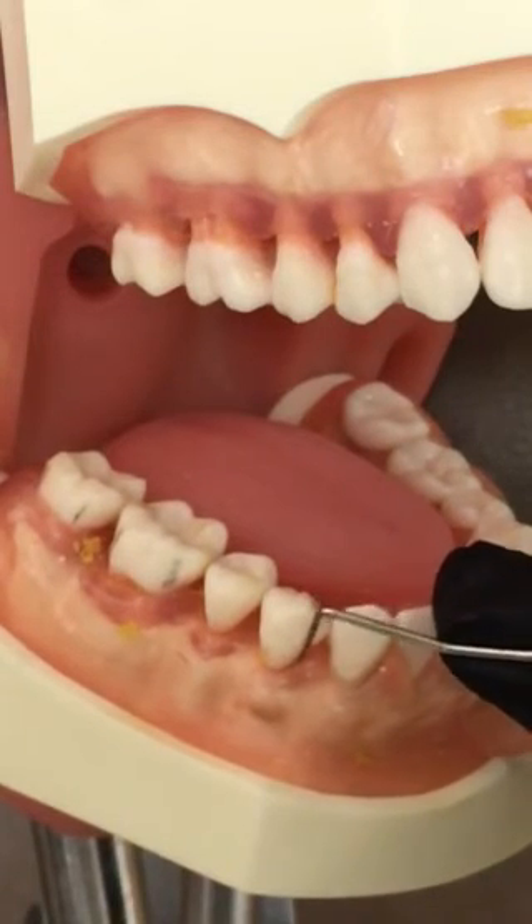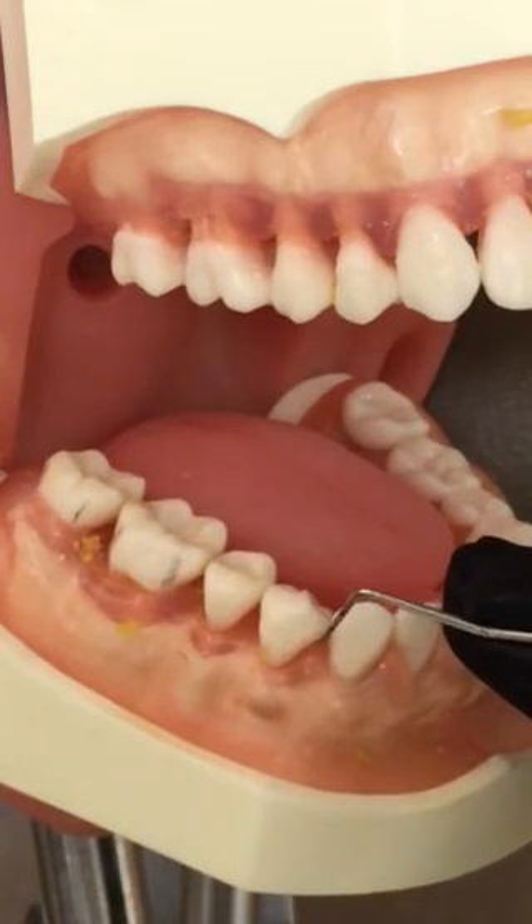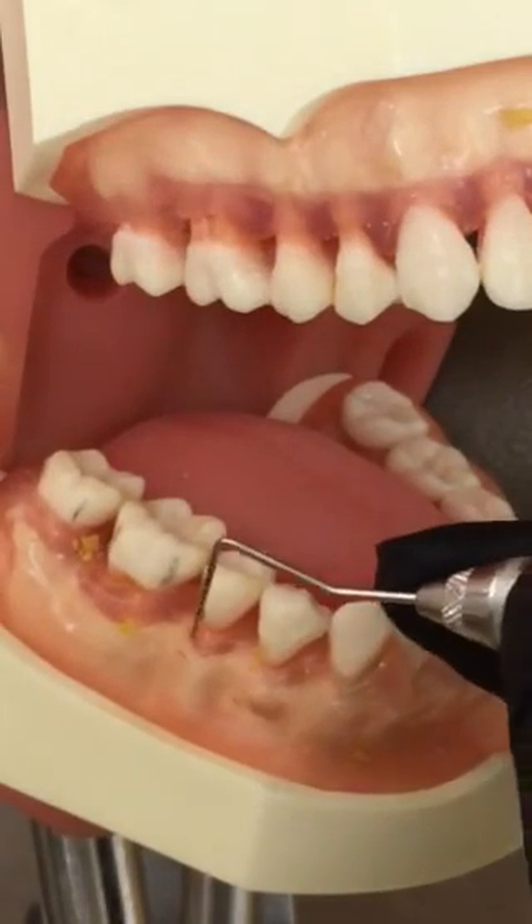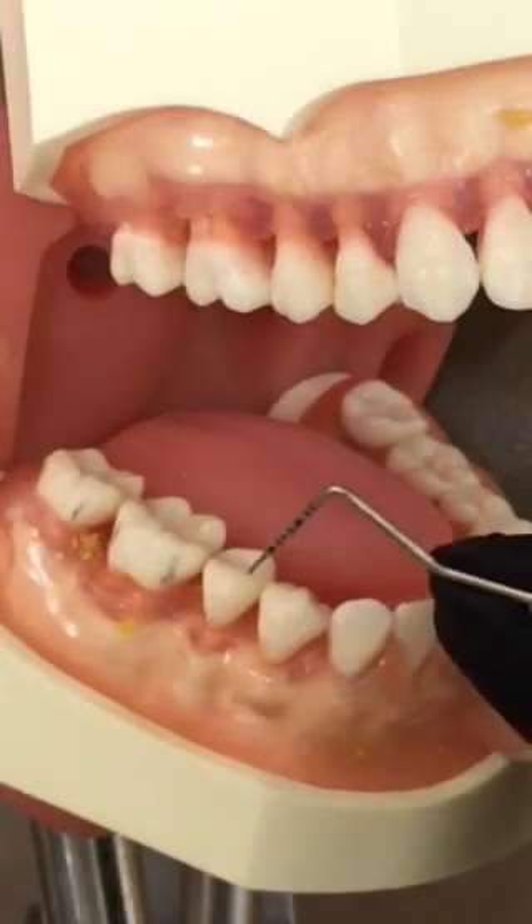This will be a very light grasp on your probe. We don't want to puncture through the epithelial attachment. We just want to measure from the gingival margin to the epithelial attachment, and that will give us our probe depth.